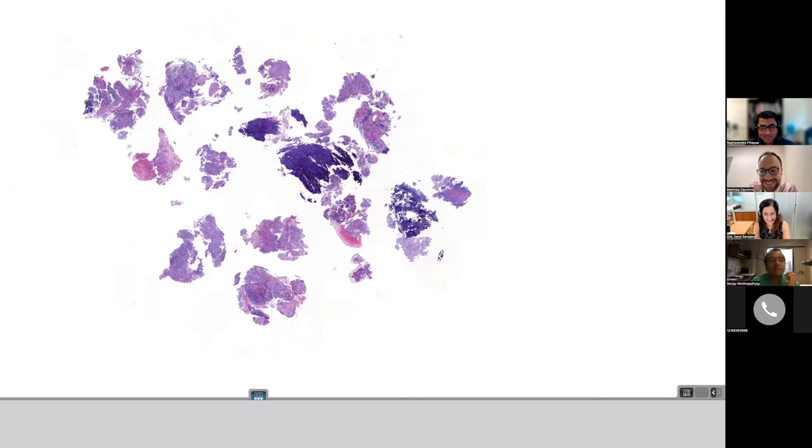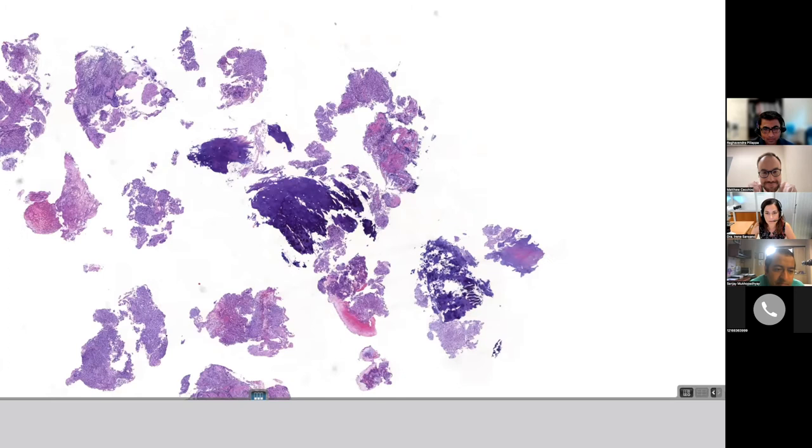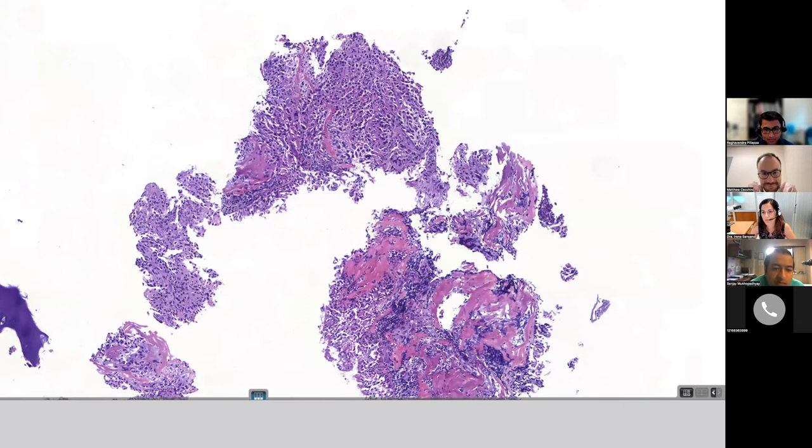This is a woman that has hemoptysis and a hilar nodule, a central nodule. What did you say, Irene? Central. I said related to ileum. I don't know the word, so better central. Oh, the hilum? Yeah, hilum. Hilar nodule without any lymph node or images suggestive of metastasis. So we have this transbronchial biopsy where you can see the cartilage. You see also this. So any of you, if you want to tell what you see, I'll go around.